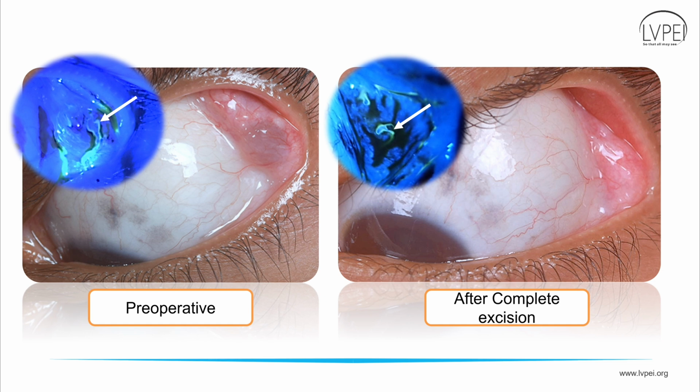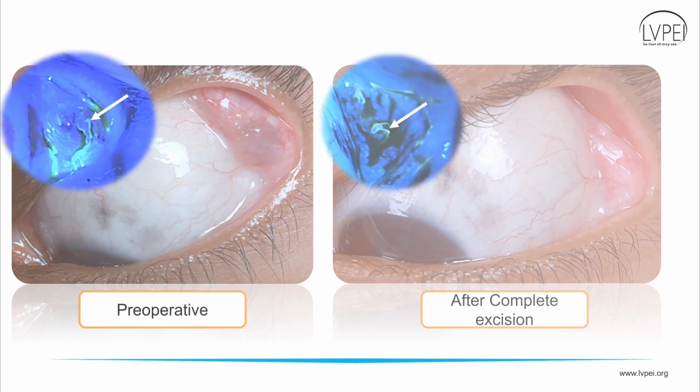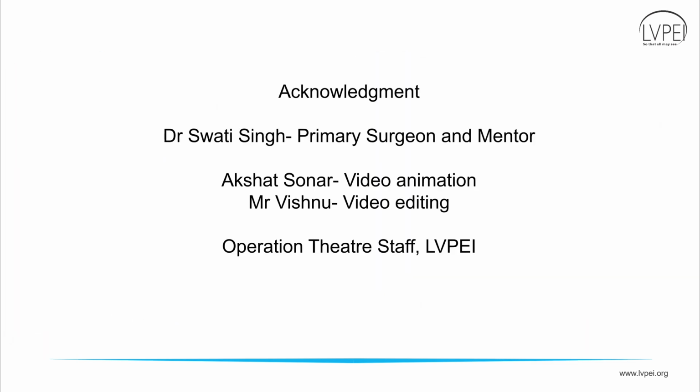Thus, fluorescein-guided Dacryops excision is a technique with low recurrence rates and a lesser incidence of causing postoperative dry eye in our experience. Thank you.